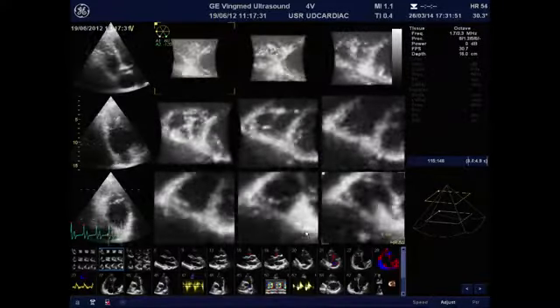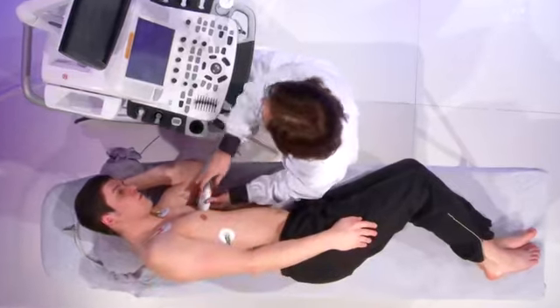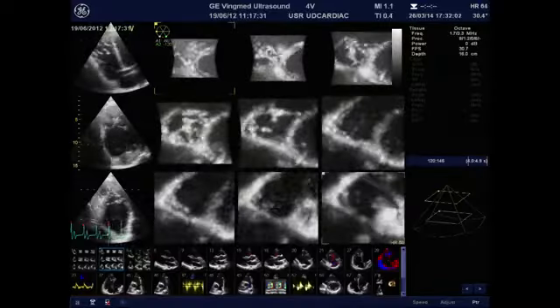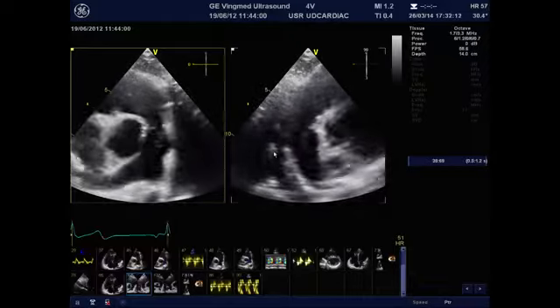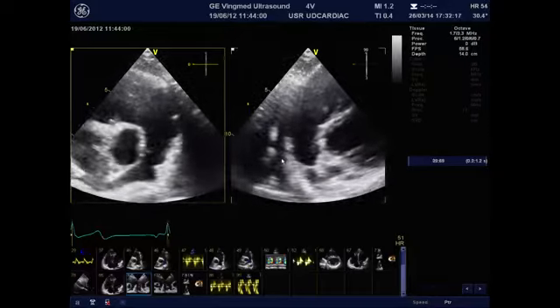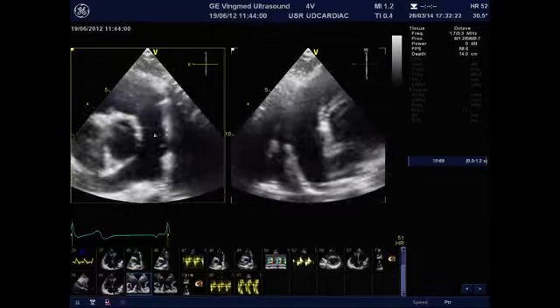And we can go now to look at the pulmonary valve from the parasternal approach. Keep in mind that the 3D probe can be used also for biplane imaging, not only for 3D rendering. So you can have a very quick appreciation of the morphology of the pulmonary valve in two perpendicular views side by side, and here you can see very nicely the lack of coaptation, and this is confirmative of the mechanism of the pulmonary regurgitation, which is organic in this case.